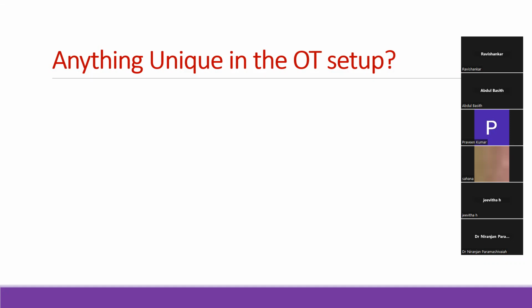To the surgeon and the assistant, sir. And how the table. How is it different? In laparoscopy, you're standing in all sorts of places around the table. So multiple monitors, which are capable of rotating practically 360 degrees. Yes, that is what is required.